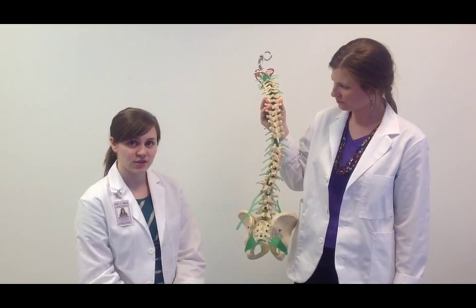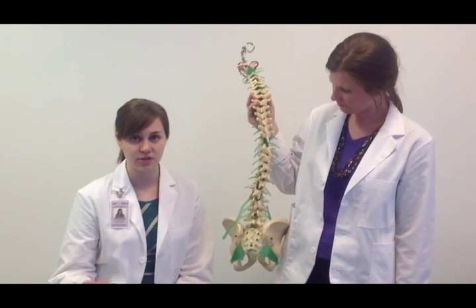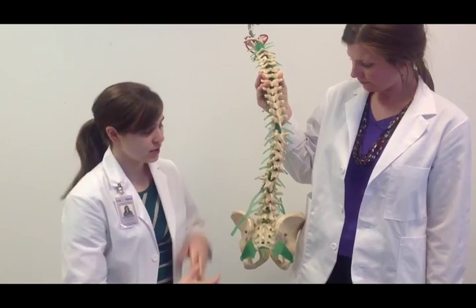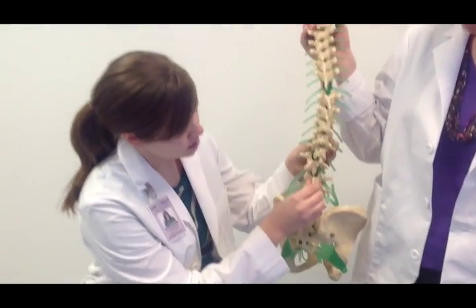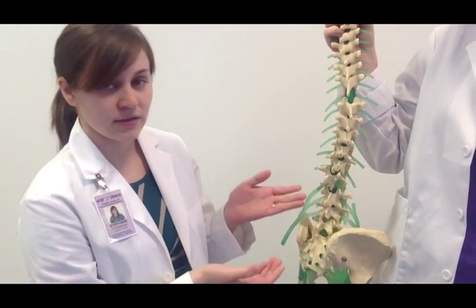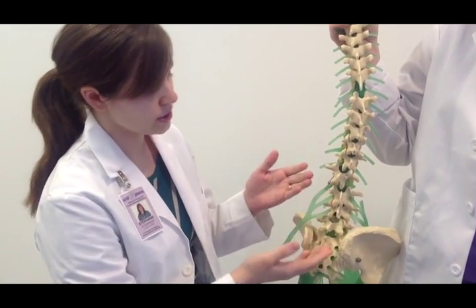Lumbar rotation consists of the five lumbar vertebrae rotating on each other. When you rotate your lumbar spine, each of these vertebrae rotates just a little bit, adding up to a total lumbar rotation — not a lot in the lumbar spine, maybe five degrees, but that's how it works.